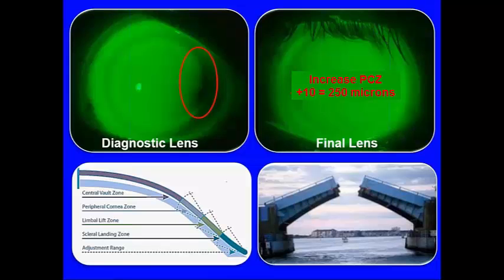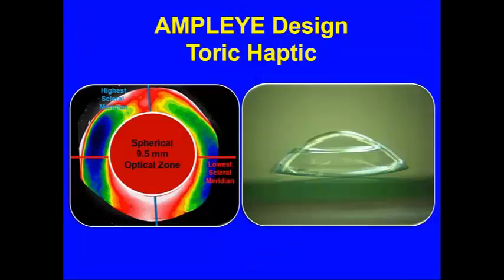Once again, we took what is an extremely difficult patient to manage with a bulging graft. We've placed one diagnostic lens on that eye. We've evaluated the fluorescein pattern, communicated it to the consultants at Optical, and we now have our final lens product.